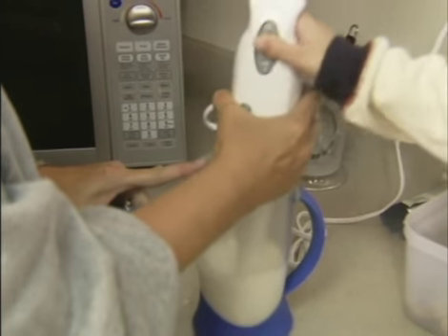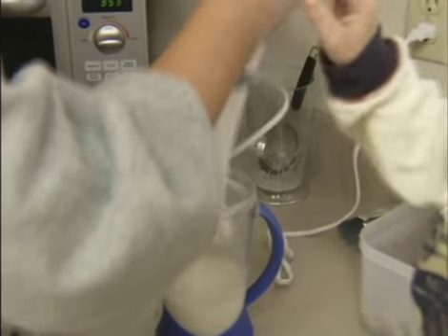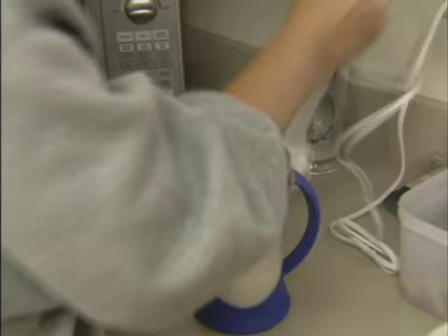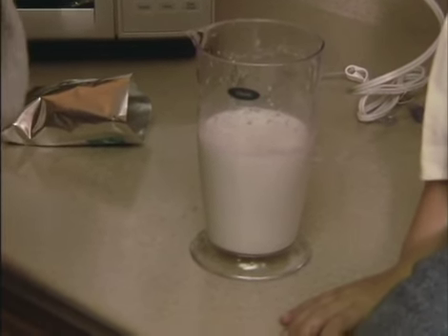If you are using blenderized or foamy formula, let it sit for 10 to 15 minutes before pouring it into the bag. This will allow time for air bubbles to dissipate and reduce the chance of an alarm.